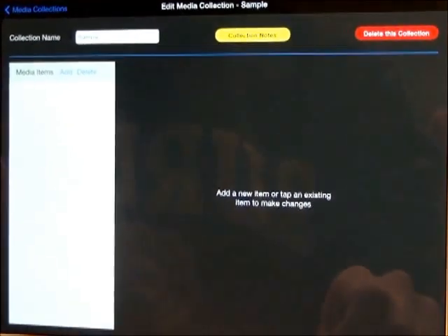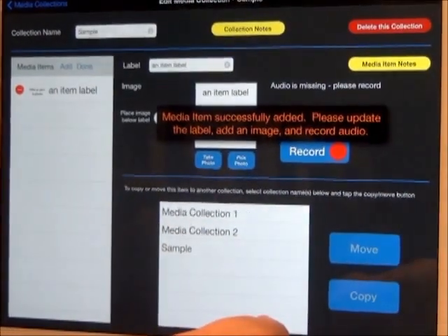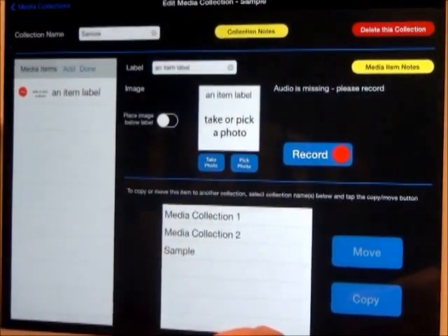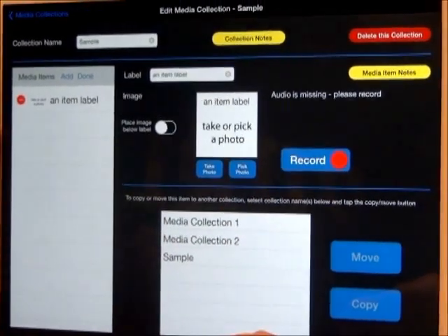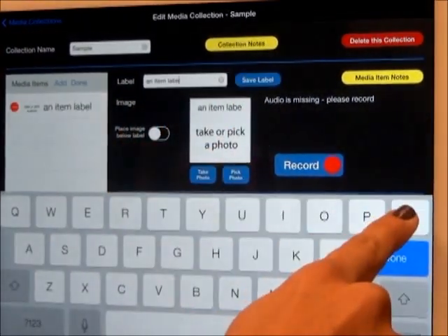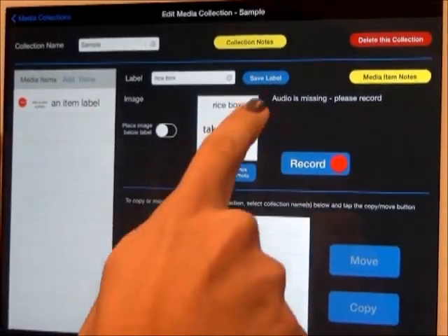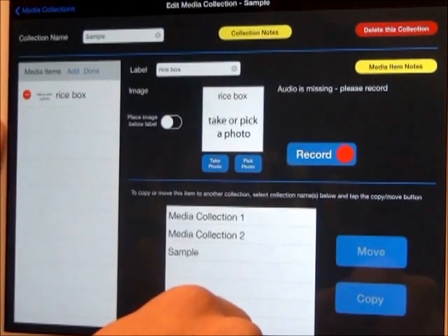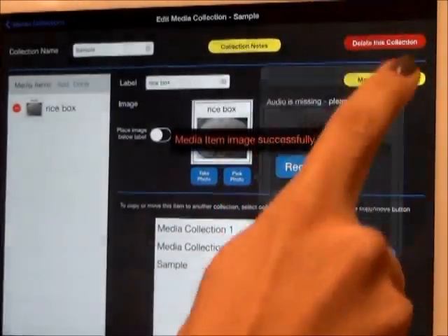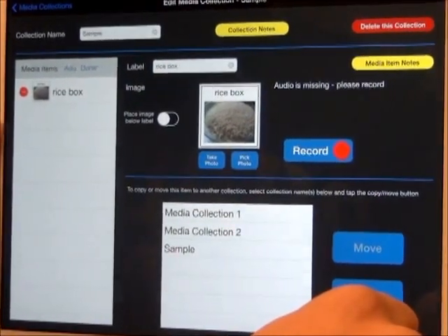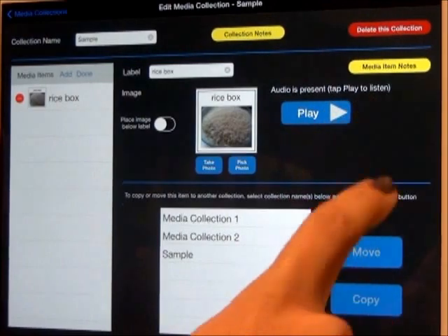Once a new collection has been created, you may now add new media items. Select Add. You will have the option to use an already existing photo or take a new one. For an example, we will use a rice box photo already stored in the iPad photo collection. First, label the new item. Be sure to save the label name. Then select Pick Photo, pick your desired photo, and click Use. To add audio to the symbol, click Record and say the item name — Rice box. Play the audio back to double check — Rice box.